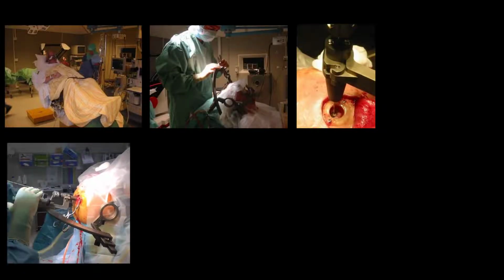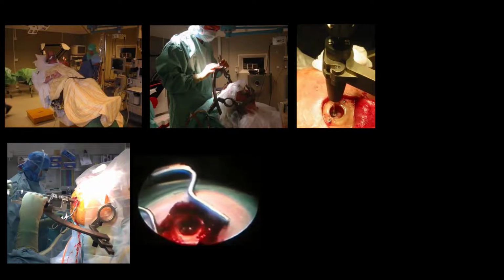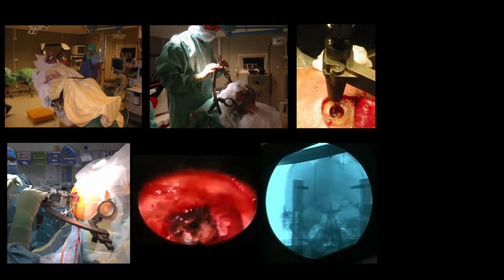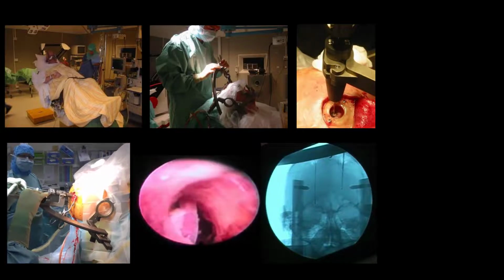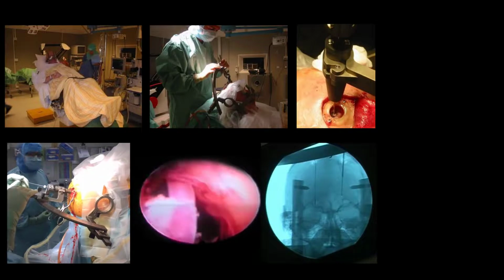So, let's look at this again. We can here see the introduction of the lead, and here we can follow the track through the brain on video. This is not part of the standard procedure, but only done for pedagogic reasons here. And we also see here how the electrode is introduced on an X-ray.